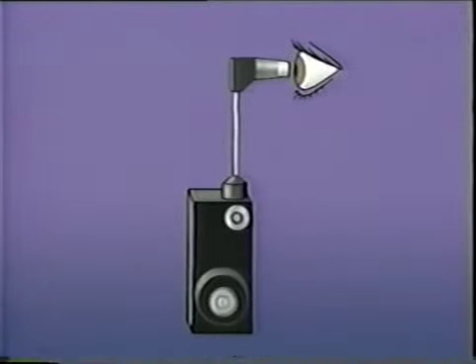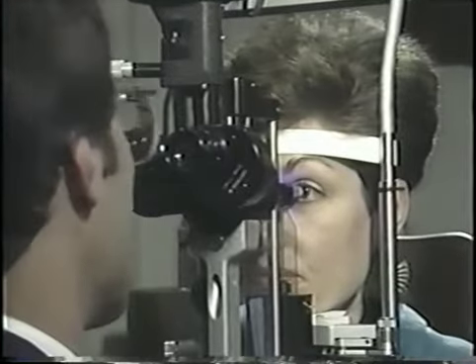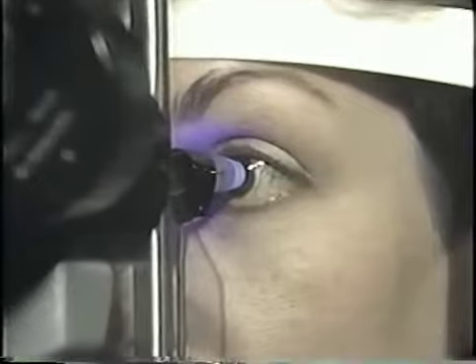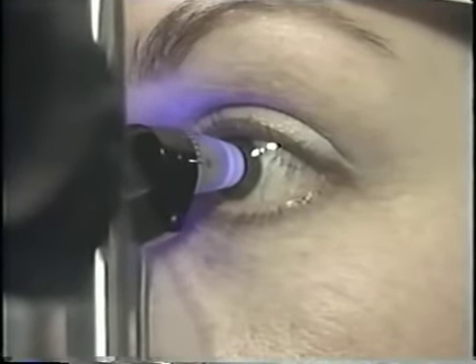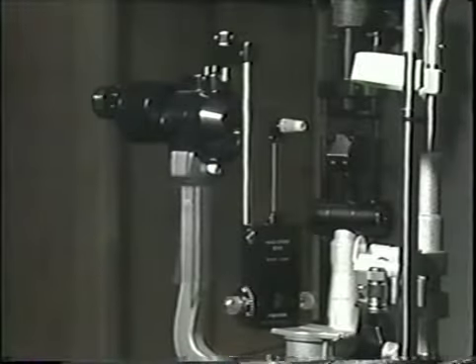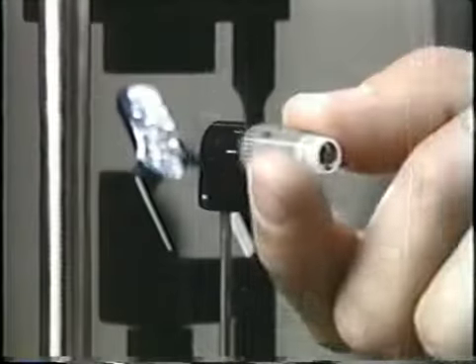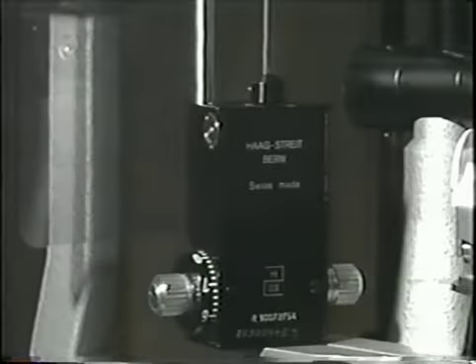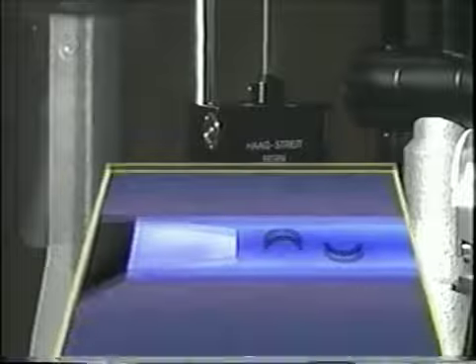Applanation tonometers measure the force necessary to flatten a corneal surface of constant size. We will concentrate on applanation tonometry with the Goldmann tonometer, since it is generally considered to be the standard to which others are compared. It is attached to the slit lamp biomicroscope and consists of an applanating replaceable tip containing a plastic biprism attached by a rod to the housing piece inside, which contains a coil spring and series of levers that are used to adjust the force of the biprism against the cornea.